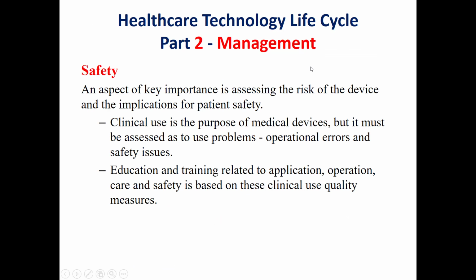So we started by talking about deployments, and we moved to talk about education. Then we talked about compliance, then maintenance, and now we'll talk about safety. Safety is an aspect of key importance, assessing the risk of the device and the implications for patient safety.